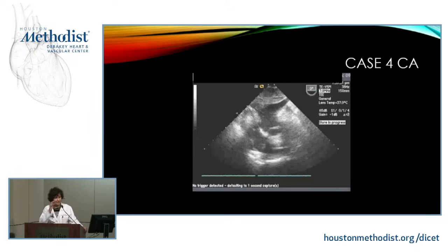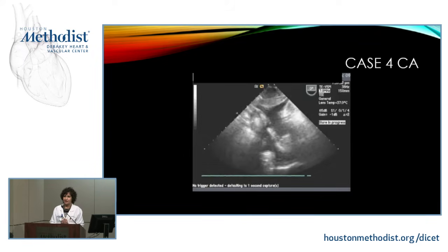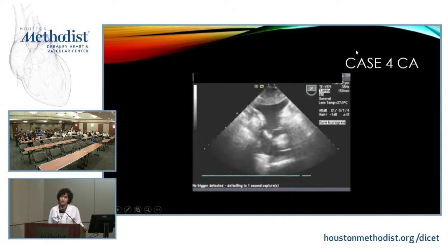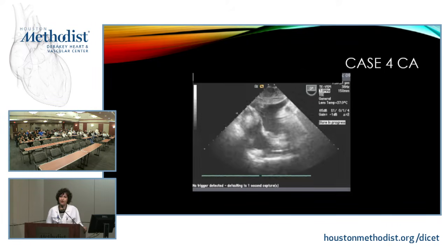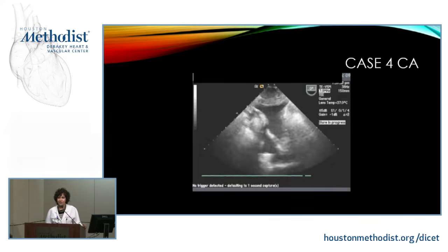Now, this is an example, and if anybody wants to take it, first of all, what echo view is it? What modality is it? Anybody? Okay, it's a TEE, right? Somebody said TEE. So this is a patient who is post heart-lung transplant, hemodynamically very unstable, and you are called to assess the patient with echo. The tech goes there, the images are very poor, you can't see anything. So we drop a probe, the TEE probe, right? This is the beauty of echo, we can do things bedside.